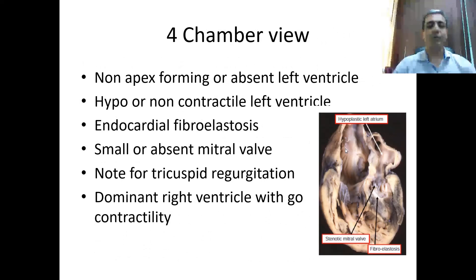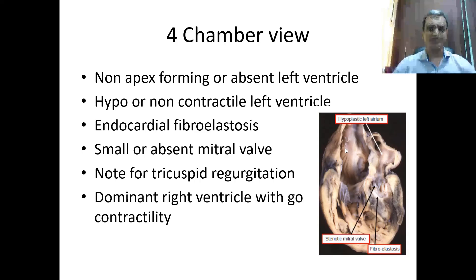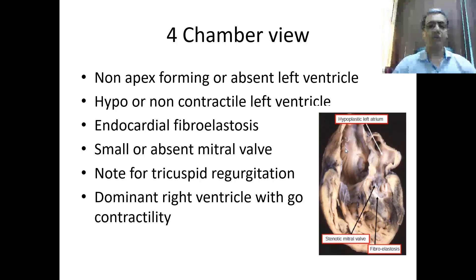Coming to the four-chamber view of the heart, we will see a non-apex-forming or absent left ventricle. The left ventricle may be hypo-contractile or non-contractile, with endocardial fibroelastosis and absent or small mitral valve. Also look for tricuspid regurgitation — it is an ominous sign; if present, chances of survival are not so good. The right ventricle will be dominant with good contractility.